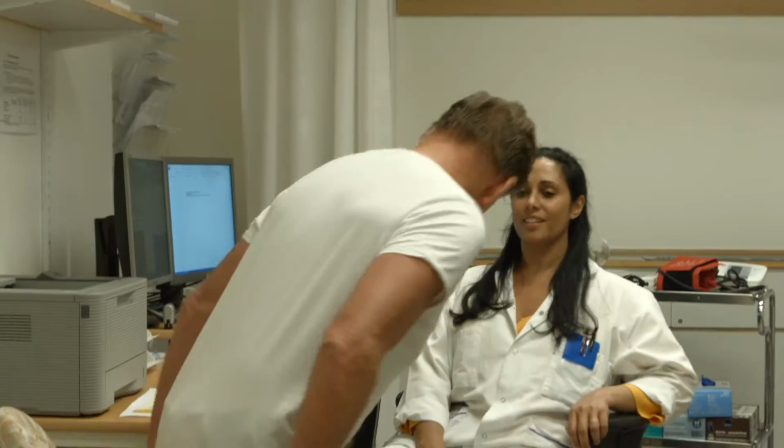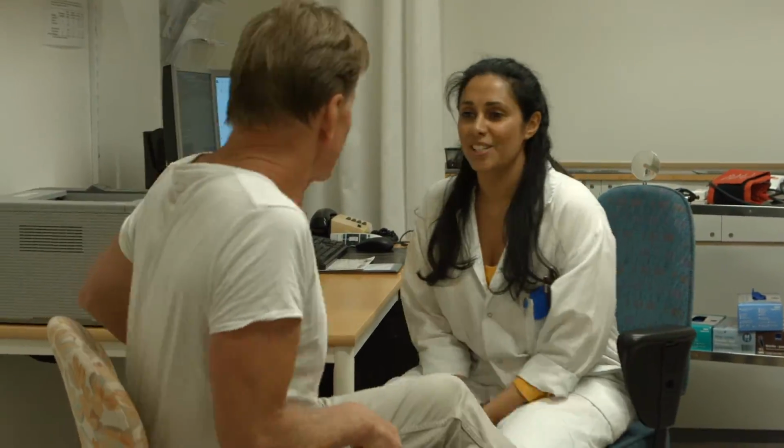After the last treatment session, you will have a treatment review with your physician. You can of course bring a friend or relative to this meeting. The physician explains your course of therapy and what to expect going forward. This is your opportunity to ask any questions you may have about your treatment. Prior to leaving, a follow-up appointment will be scheduled.